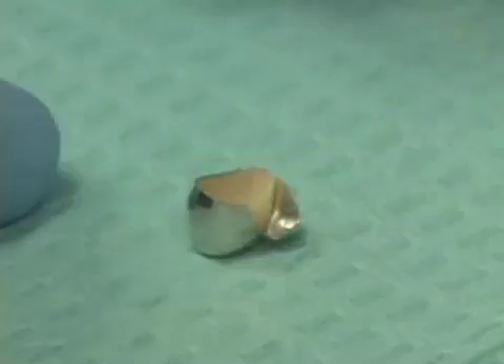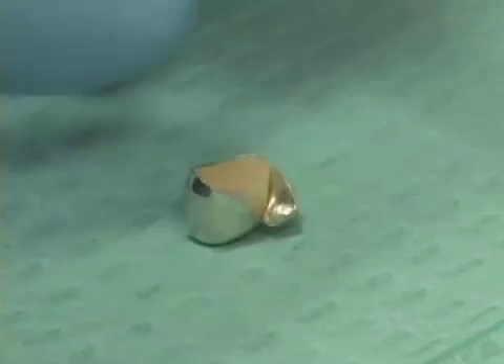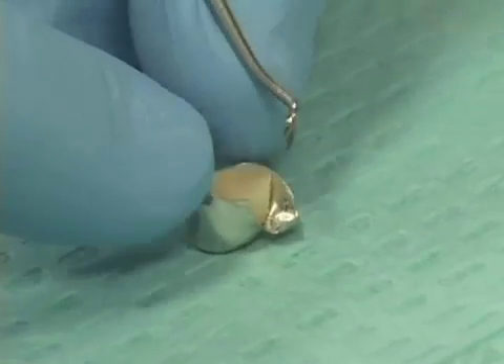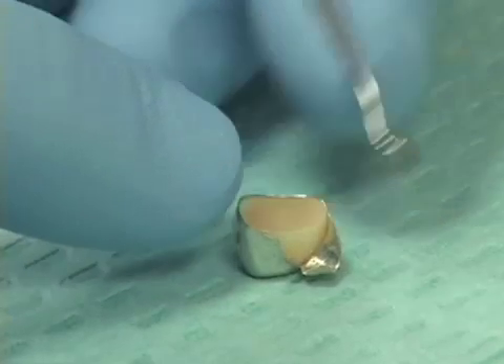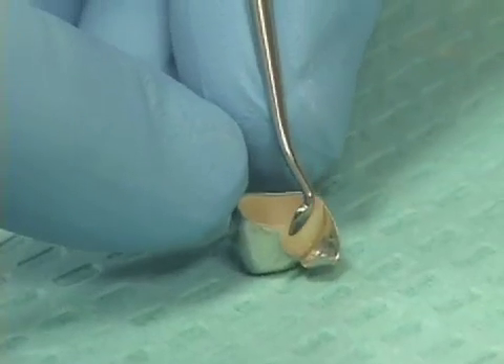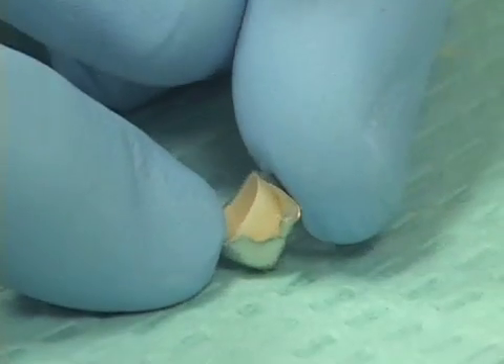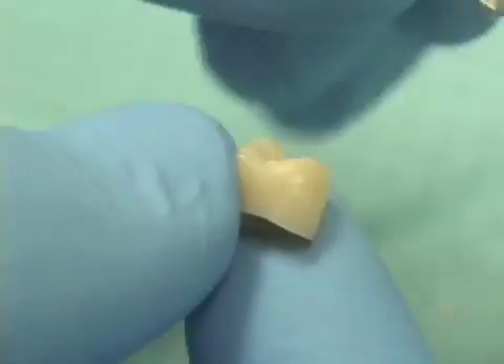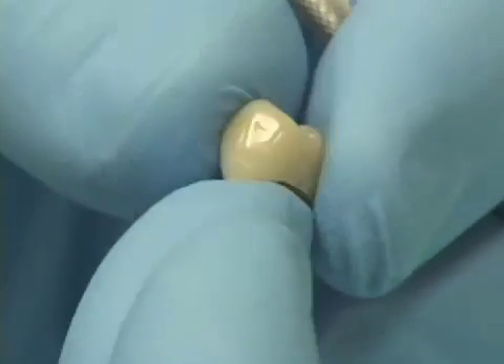Once the acrylic has set up or polymerized inside the aluminum shell crown form, carefully place it on the laboratory bench, take the pointy tip of the cleoid discoid, stabilize the aluminum shell crown form and work the edge of the cleoid discoid. What we've done now is peel off the aluminum shell crown form and we're left with a solid plastic tooth.